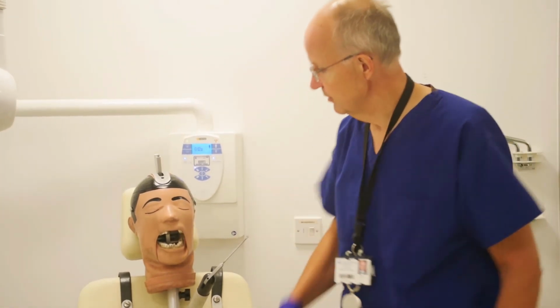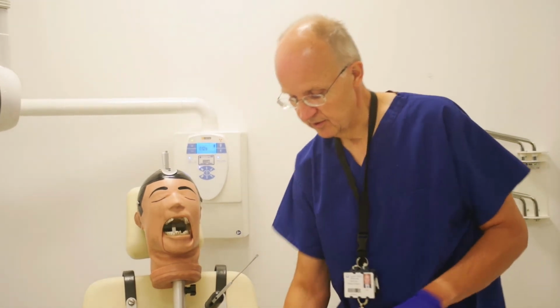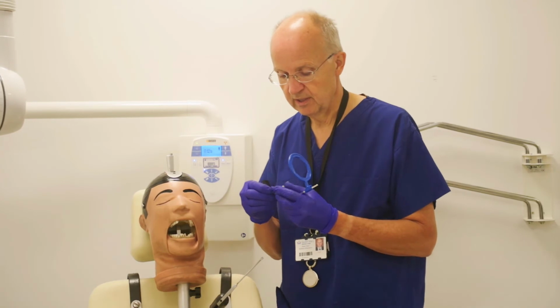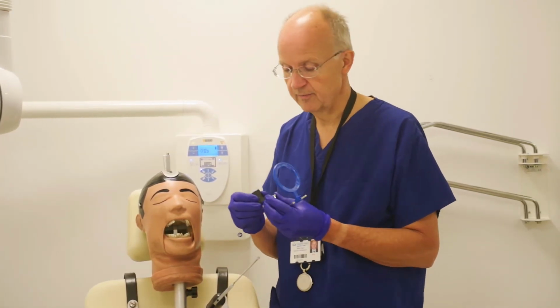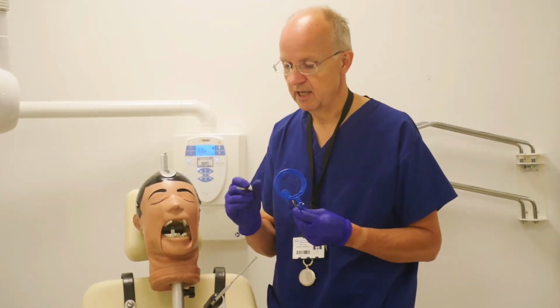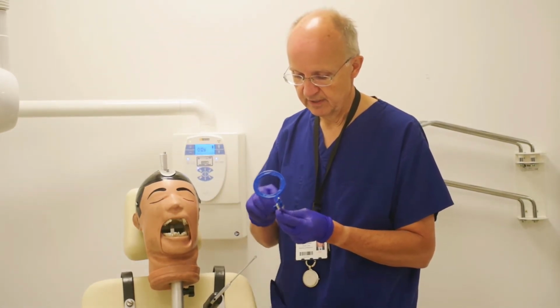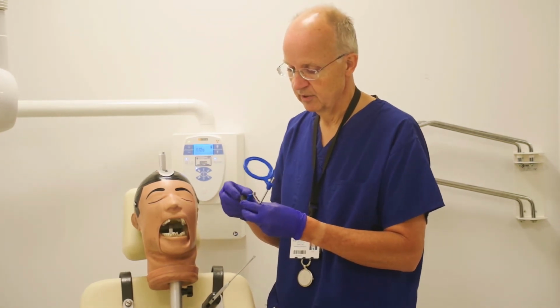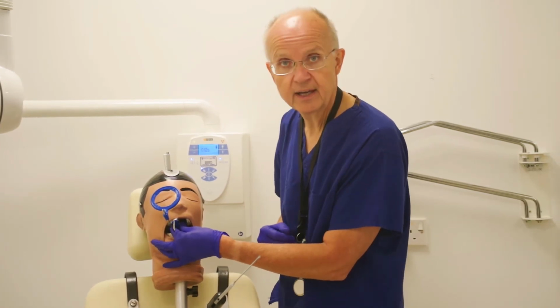Okay, so that was the posterior periapical. I'm just very quickly now going to take you through doing an anterior periapical. What we're going to do is the upper right 3, so again an upper tooth. You'll remember that we're going to use the anterior holder, which is the blue one. We're going to use a size 0. We're going to place it vertically because of the narrow arch here at the front. And we're going to pop that in, ask the patient to open the mouth, pop it in up there and ask them to bite down.